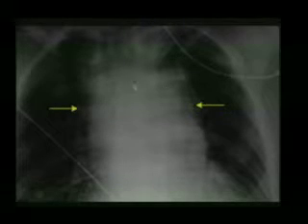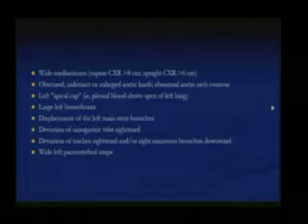So this is the chest X-ray. Usually the chest X-ray will demonstrate a widened mediastinum, as you can see on this X-ray, and it gives us an indication that the patient likely has a thoracic aortic injury, but there are several other reasons why the patient can have a widened mediastinum. Again, as we discussed, a supine chest X-ray greater than 8 centimeters we call a wide mediastinum. Upright should be 6 centimeters. So 6 and 8 are the numbers to be remembered.